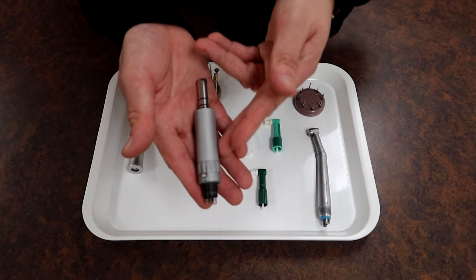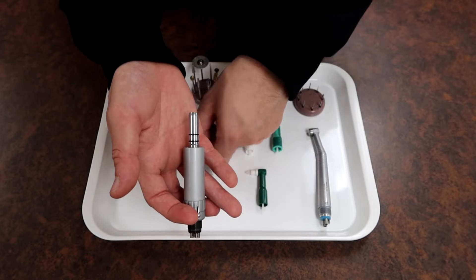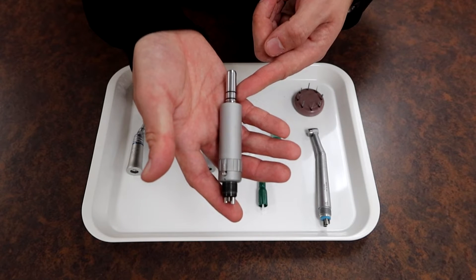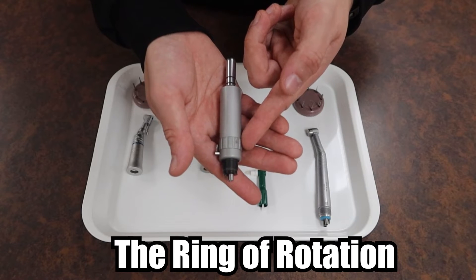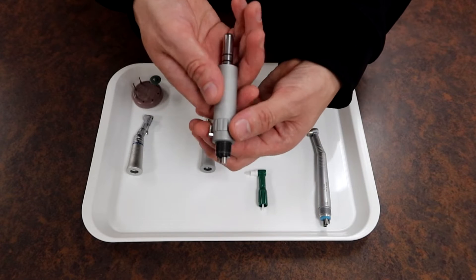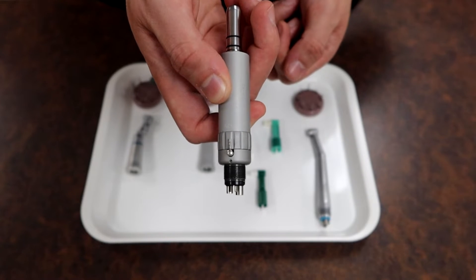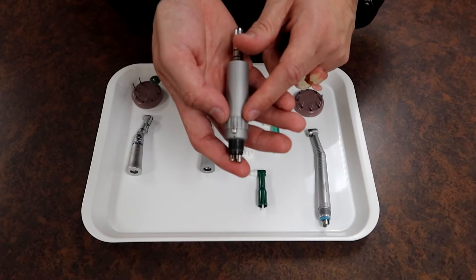On our slow speed motor, some things to take notice of: there's a slip-on space that accommodates our other attachments, which will just easily slip on and you may even hear a click. There's also a ring at the bottom responsible for its rotational direction — normal cutting direction or reverse — just twist that ring. It may even have markings: F for forward and R for reverse. Usually it's going to be in forward motion. There's also a little port that serves as a waterline hookup.